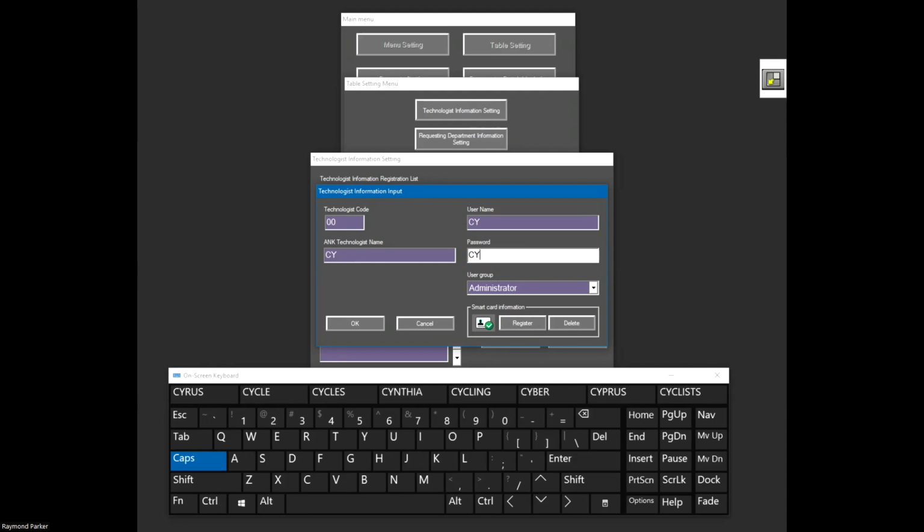Should you have purchased or your customer purchased the RFID login, it does speed things up. There's no typing. You just flash the card against the card reader on the back of the portable, and the user is logged in. This is for the FDX console. This is not talking about the portable PID password. So to do that, you'll see here it says register. In this instance, I want to delete. I've already played with this unit a little earlier today.